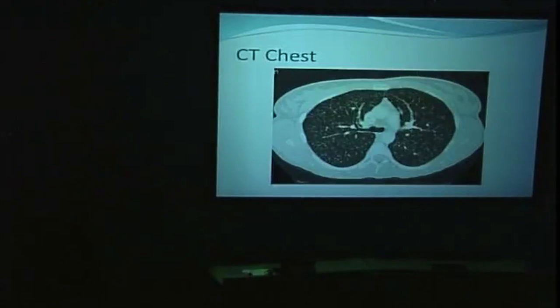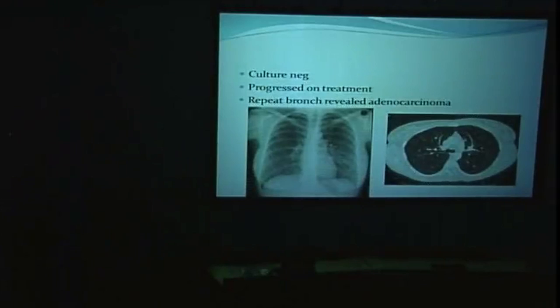CT was done, and that showed a tree-in-bud appearance, with lots of fine nodules throughout both lungs. That was taken as corroboration of the diagnosis of TB. However, the tests didn't really confirm that. It was culture negative. TB treatment was commenced.